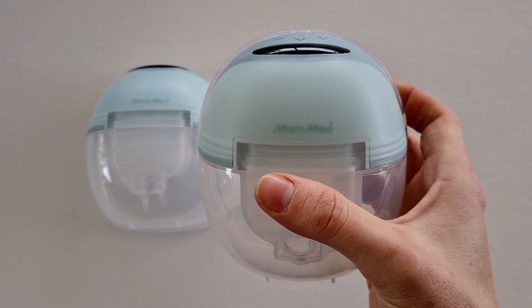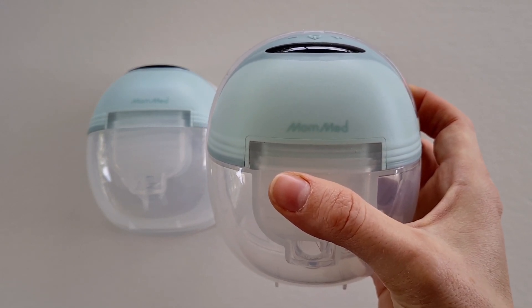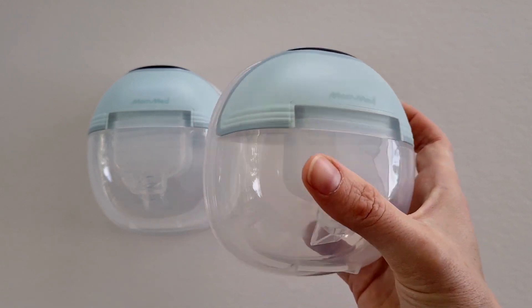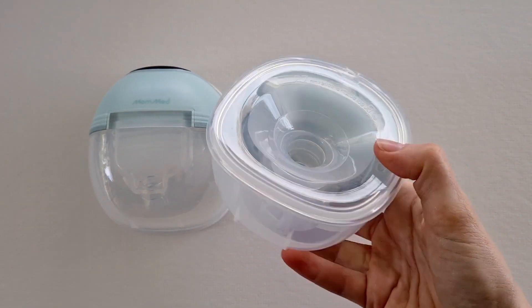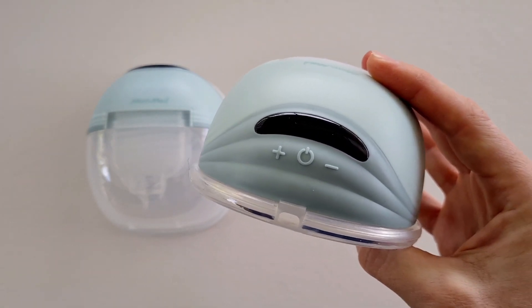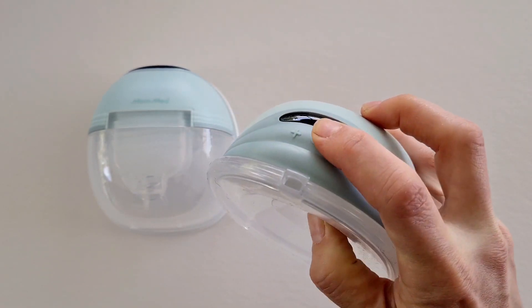I think the Mummed S21 is a fantastic wearable breast pump packed with features at a budget price. Let's take a look at some of these features, because to be honest, for a breast pump at this price, I really do feel that you are getting value for money. To start, there are 12 different suction levels.